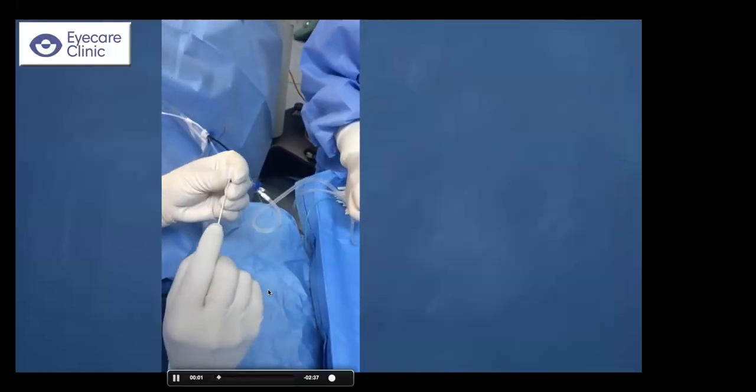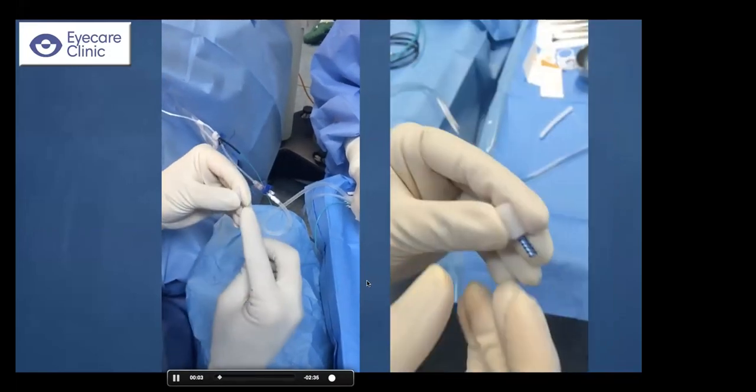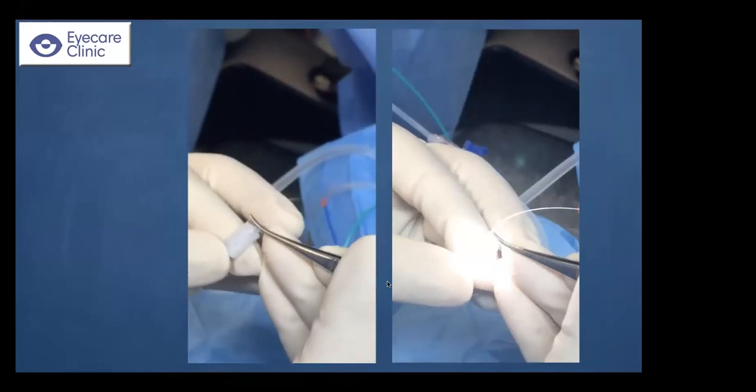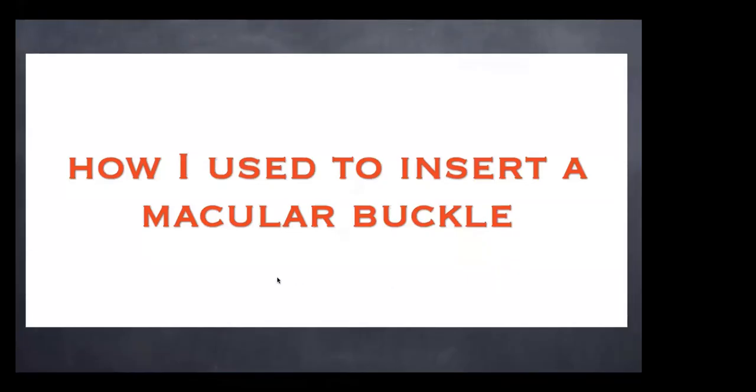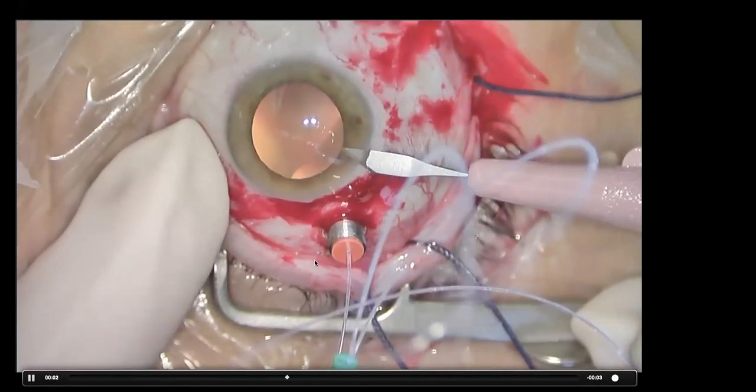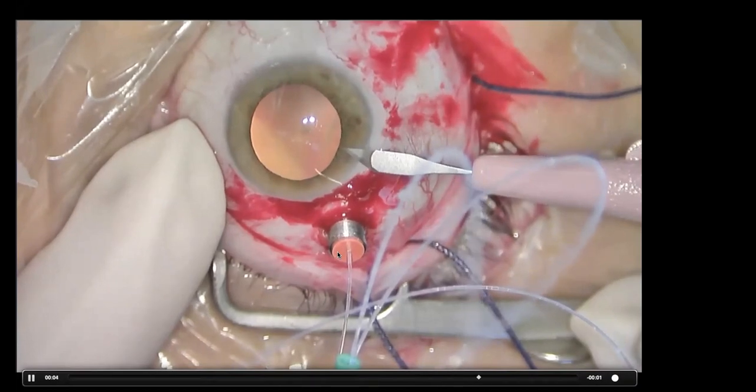I added the lights to use transillumination. It takes 5 minutes to do it in the OR, but this is totally off-label. So I used to insert it through the superotemporal quadrant after making a paracentesis.